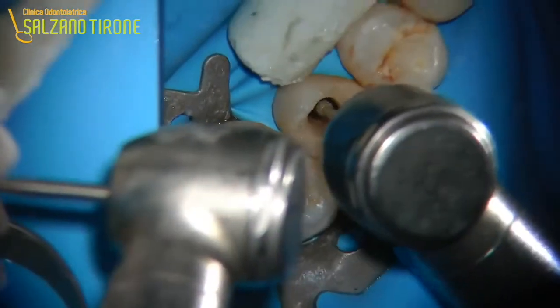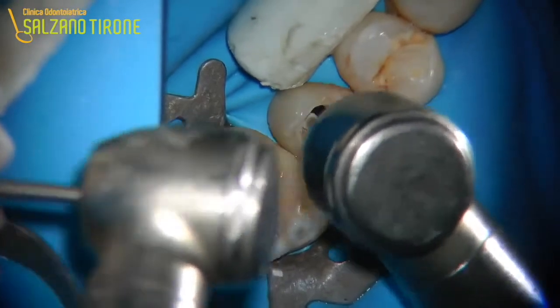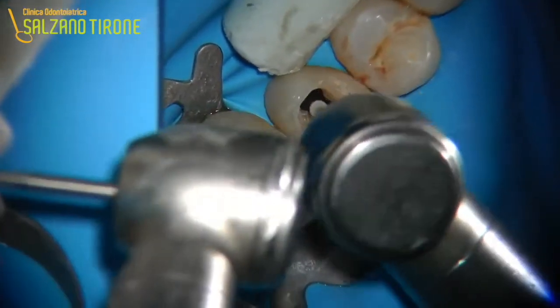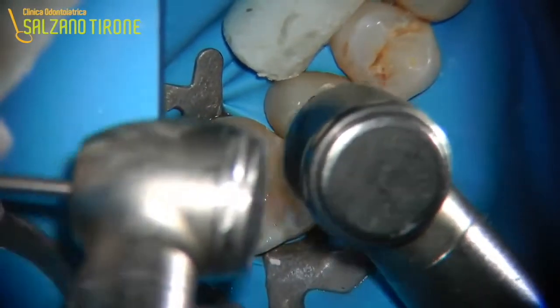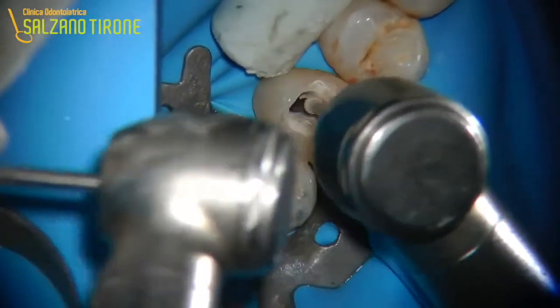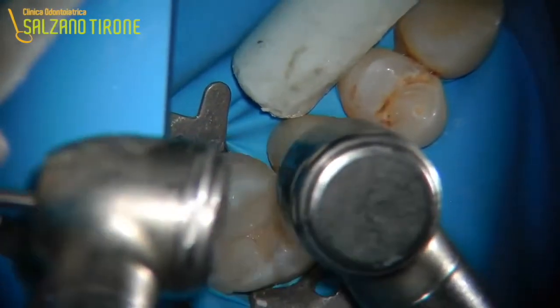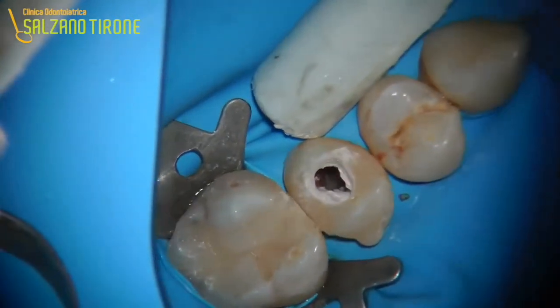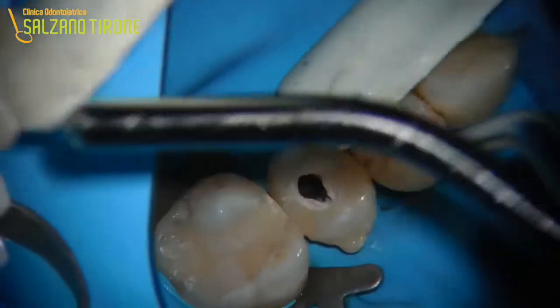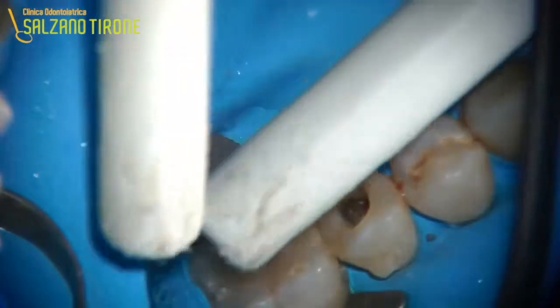Then we peel on our way out as if we were making an opening access for an incisor to take out the undercut below the cingulum. And this can be done with diamond ball bars on a turbine, or, as we can see now, even with a rose bar for contrangle, which works a little more slowly and can help remove the granulation tissue, understanding where the dental tissue starts regaining its consistency.